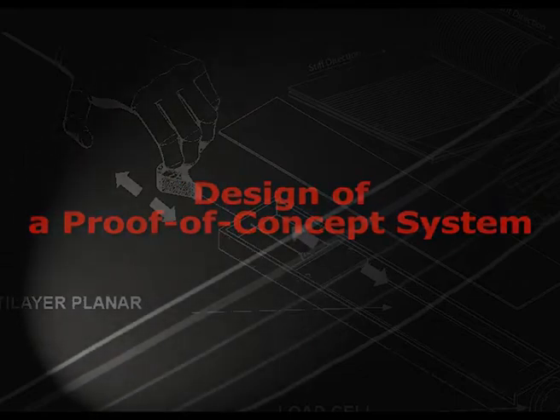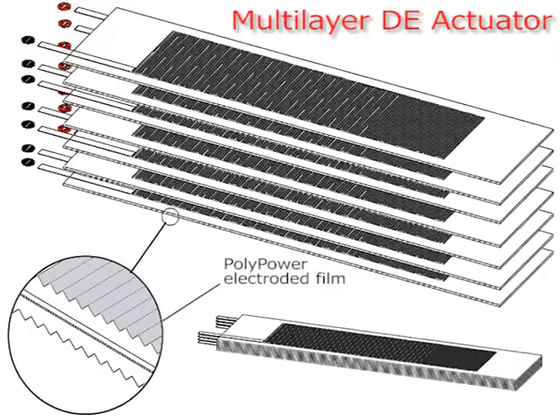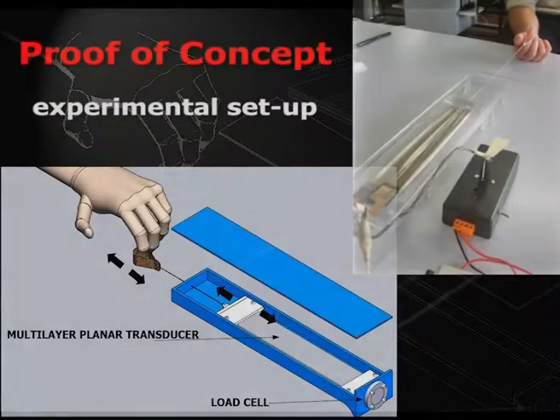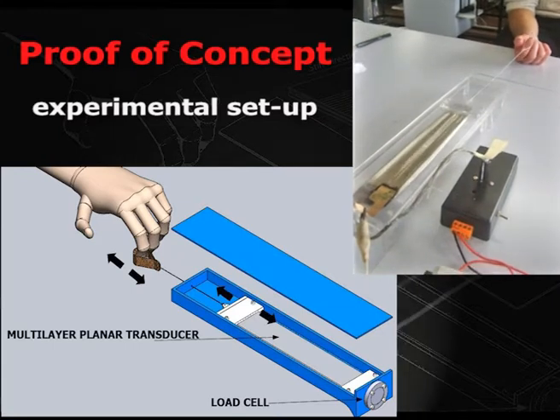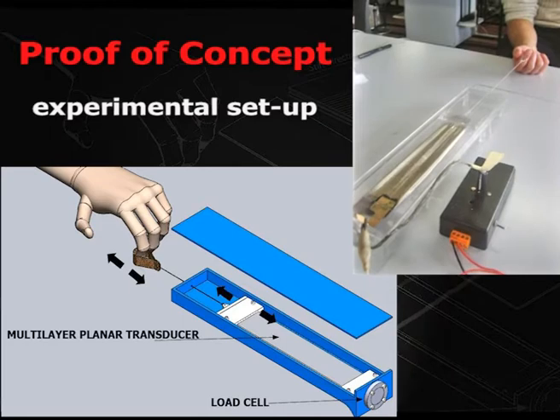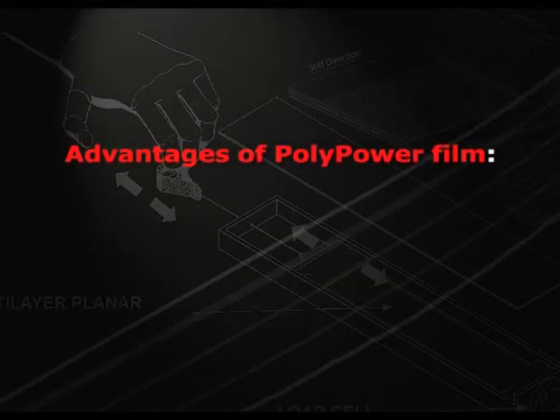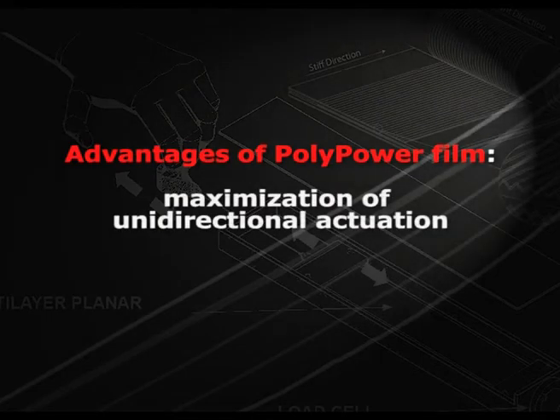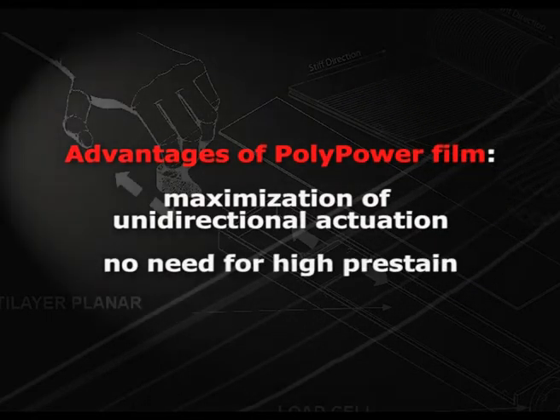The actuator consists of a multilayer stack of PolyPower electrode film. As a proof, in our experimental setup, the user pulled a tandem wire connected to the multilayer actuator, which was connected to a load cell to measure the force in real-time. Advantages of Danfoss polymer film consist of maximization of unidirectional actuation and no need for high pre-strain.